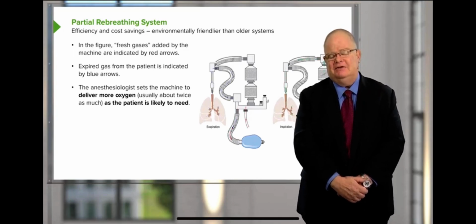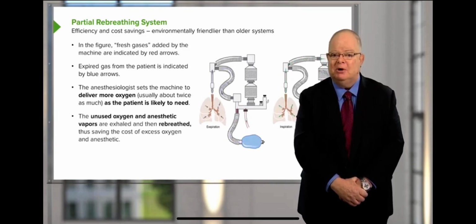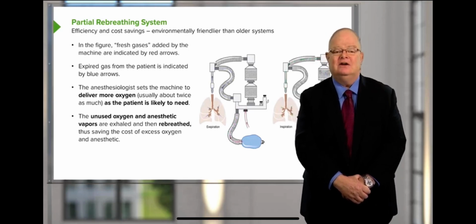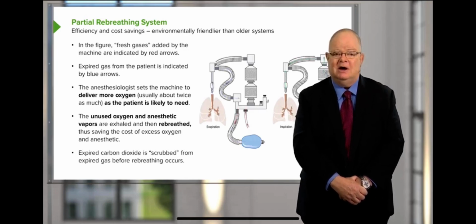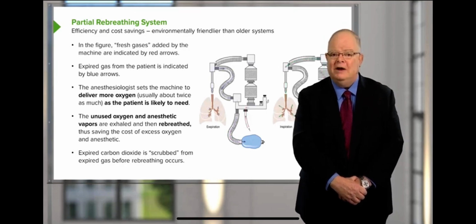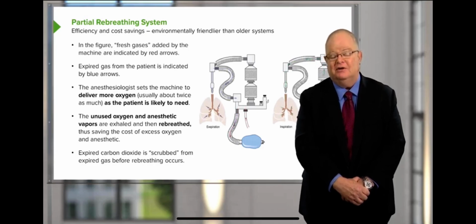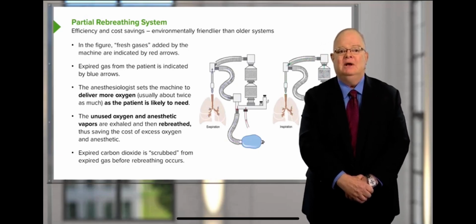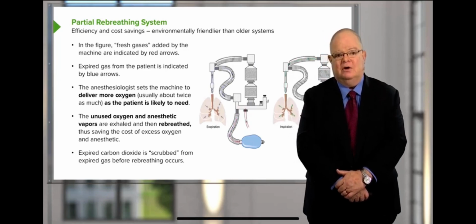The benefit of this kind of system is that we don't waste a lot of materials. Patients expire unused vapor and inspire it again, which allows them to remain anesthetized, even rebreathing the same anesthetic vapor repeatedly. They get rid of carbon dioxide with every breath, and they get new oxygen with every breath. The overall waste of gas is very low. So we're not venting gas to the atmosphere, particularly seeing that vapors do have some environmental risks associated with them. And we're also maintaining cost effectiveness by reducing the amount of vapor that we use overall.